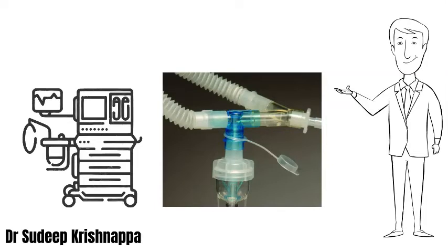On a different note, not as a function of the device used to nebulize, but of the drug being added: whenever we add any of the respiratory medicines like salbutamol or budesonide, you'll start realizing, especially if the patient is on an anesthesia machine with automated gas analyzers, that they would start recognizing these agents as halothane.